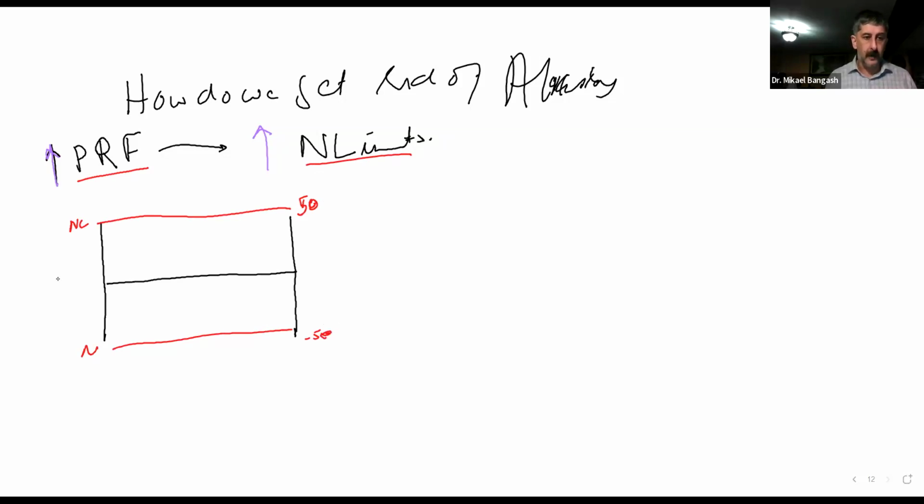Now we might have had a positive Doppler shift with a hell of an aliasing.